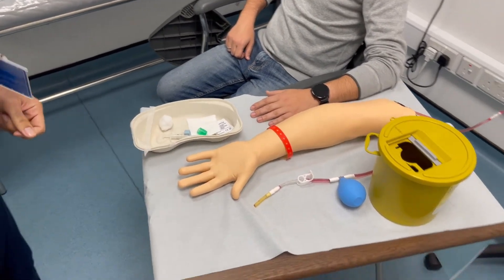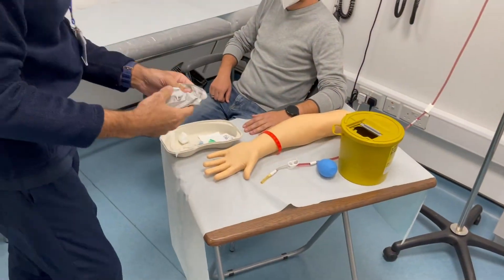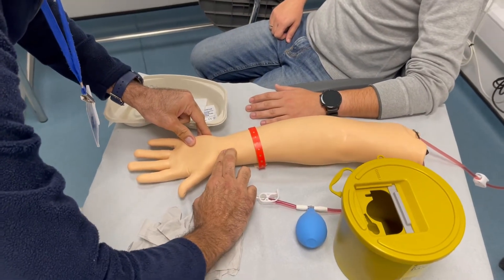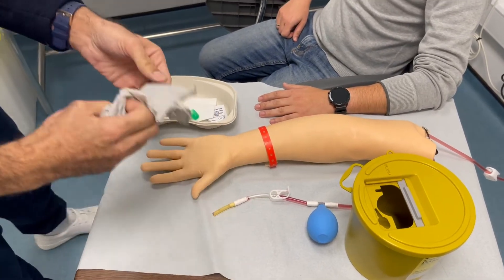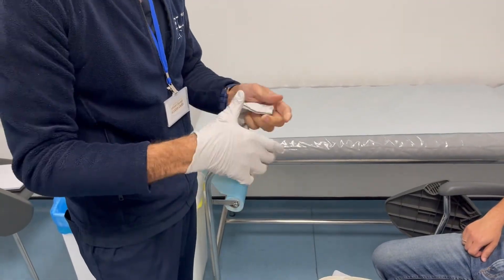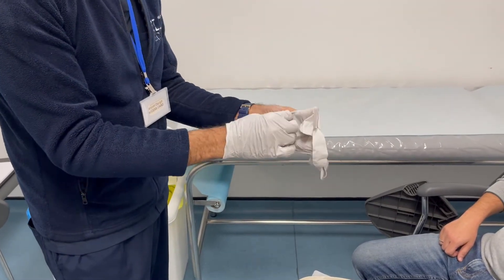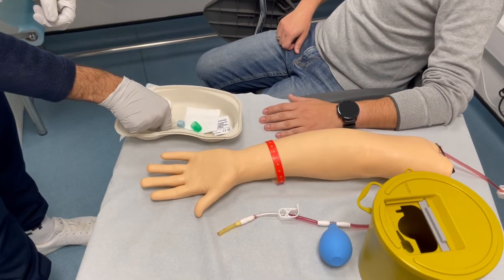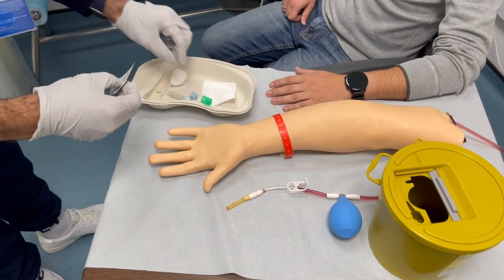I'm just going to grab my gloves and palpate the radial artery. So how are you doing otherwise? How is your day going besides being in the doctor's office and getting your blood drawn? This will be over soon, so fear not.